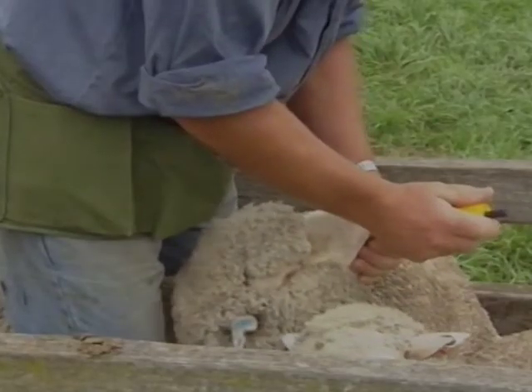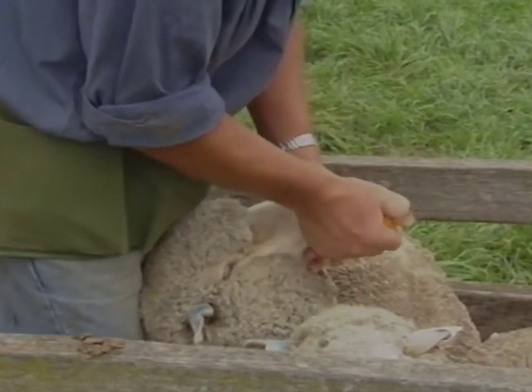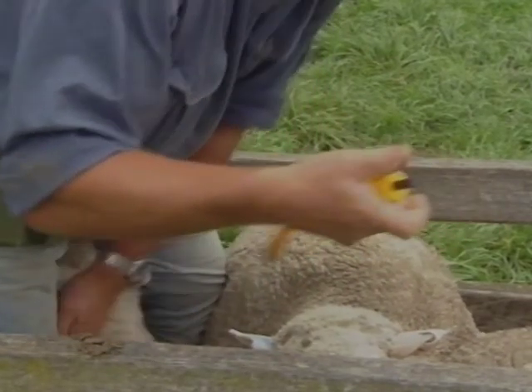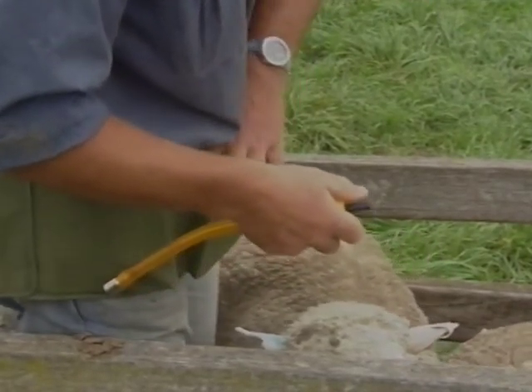Once the applicator is drawn all the way in, with the hilt at the corner of the lips, gently press the button to release the capsule, allowing the sheep to swallow the capsule, passing it down into the rumen. Then, with the button still fully depressed, slowly pull the barrel out. Observe the animal for a moment to ensure the capsule has been swallowed.